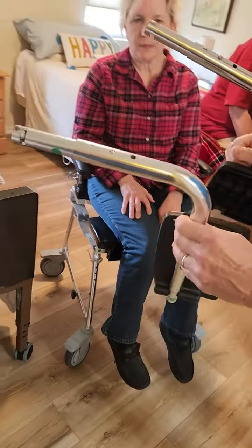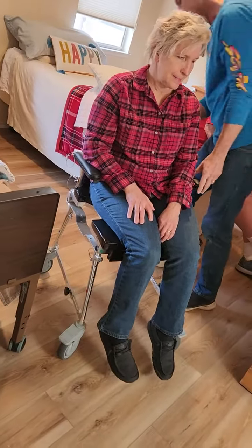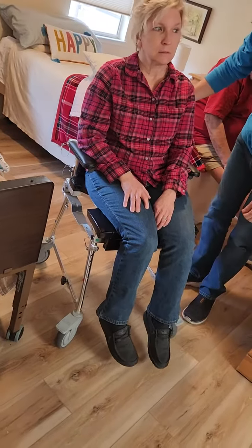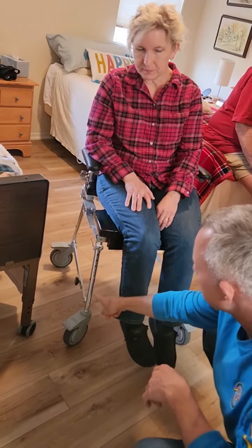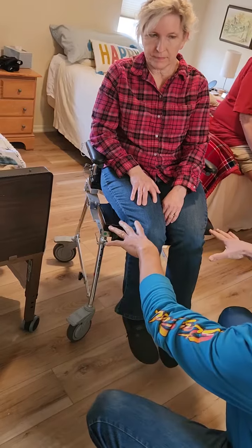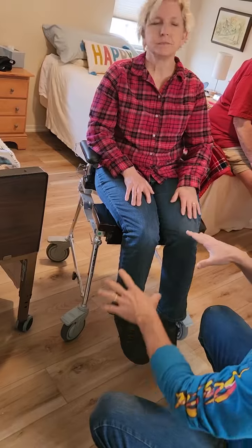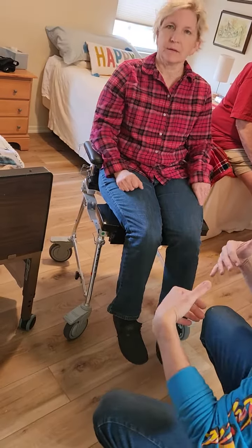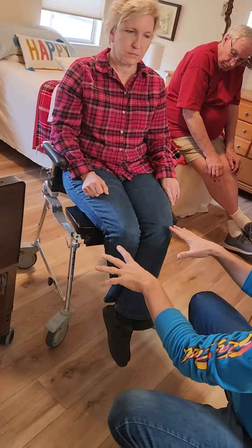Setting the legs aside, that's pretty much all the adjustments. There are height adjustments on each leg independently. Right now we've got it adjusted so that this chair, which is also a commode chair, is just tall enough to clear the toilet. That's probably the best height right now.